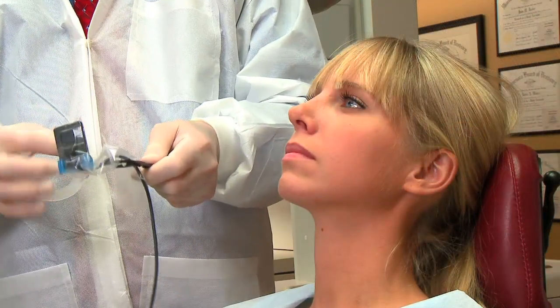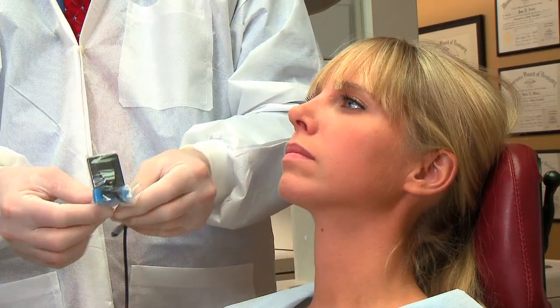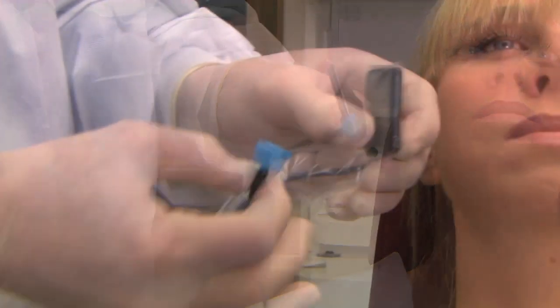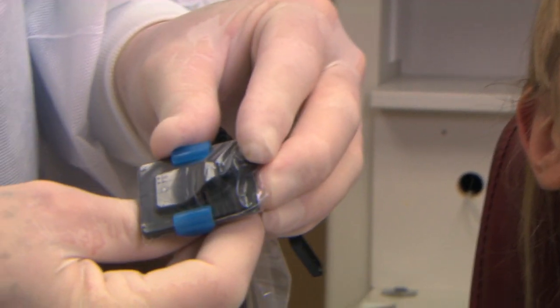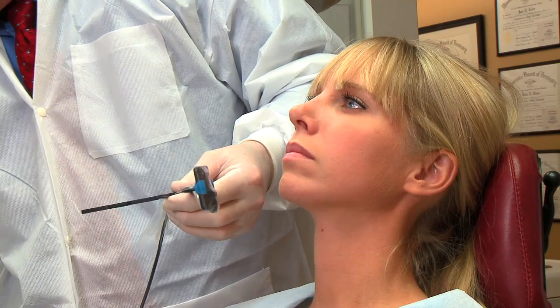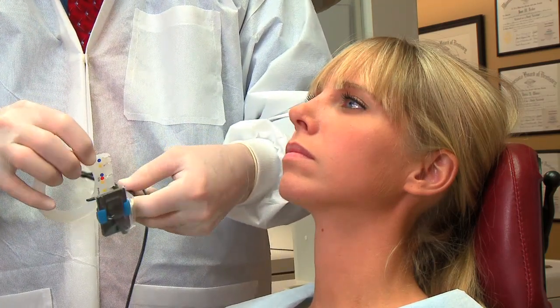In addition to all 6 anterior PAs, the blue holder is used for vertical bite wings. Remove the bite block. Take the sensor and push it to a center position in the holder. Put the ring in the bite wing position in place, and you're ready to take a vertical bite wing image.